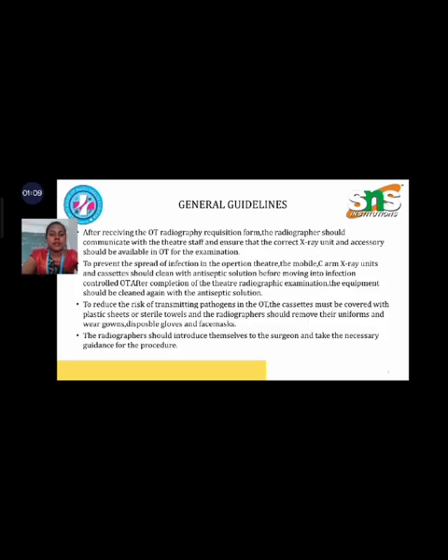What are the general guidelines? After receiving the OT radiography requisition form, the radiographer should communicate with the theatre staff and ensure that the correct X-ray unit and accessory should be available in OT for the examination.